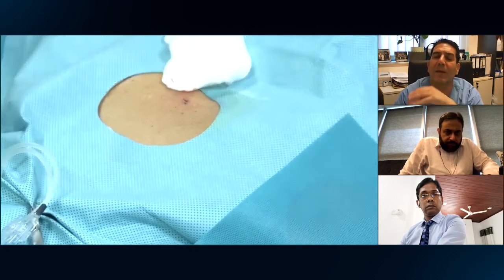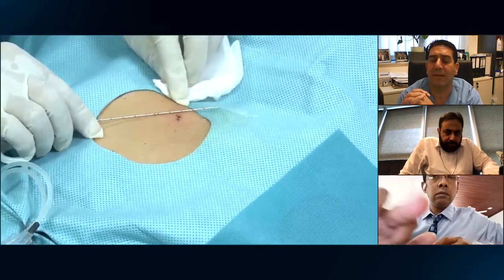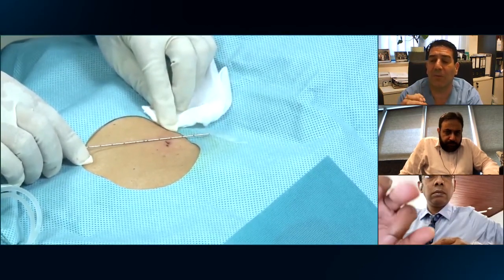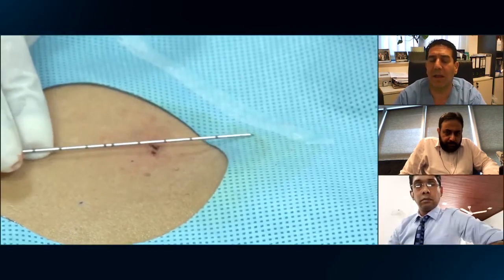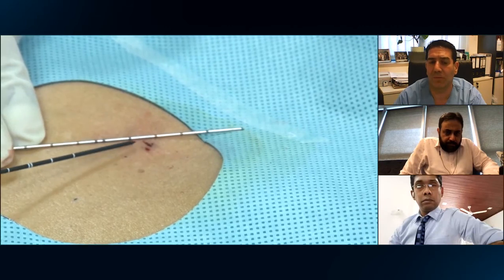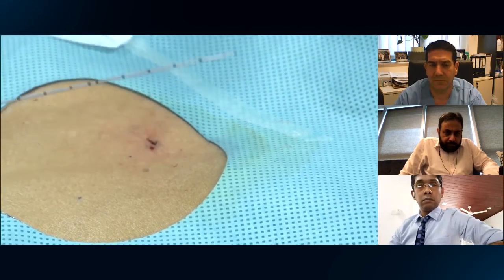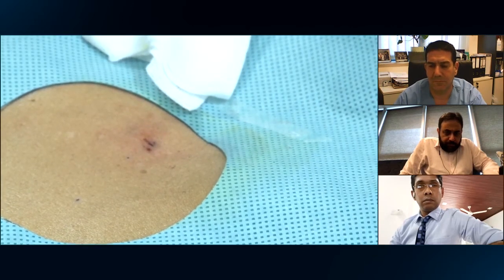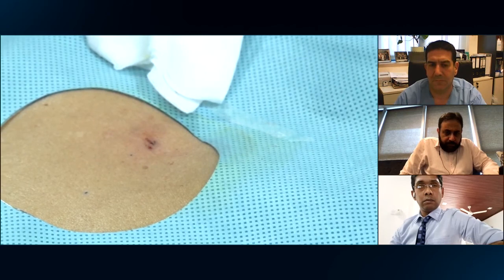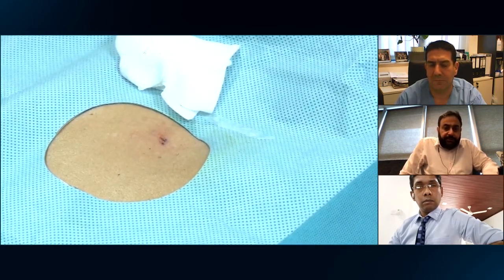In our experience, in such small pneumothorax, without any problems of respiration, we will just leave the patient lying on his back and recontrol. Yeah, you are right. I agree with it. That's what we normally do.